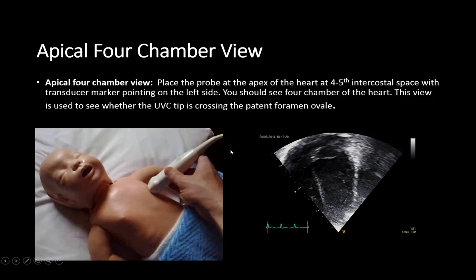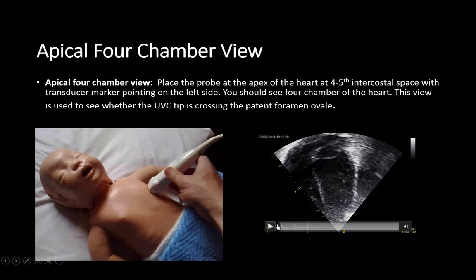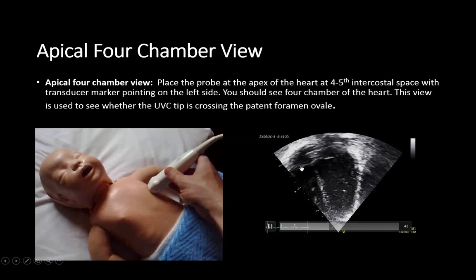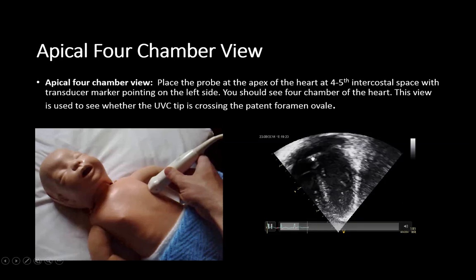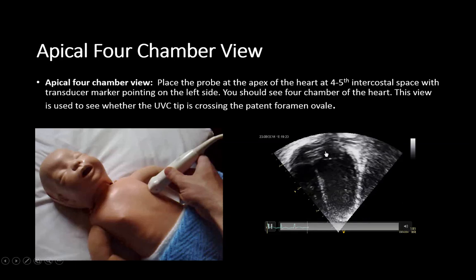The apical four-chamber view is another position used to assess whether the catheter tip is crossing the patent foramen ovale. The transducer is placed at the fourth and fifth intercostal space at the cardiac apex in the mid-clavicular line. From there you can see all four chambers, focusing on the relationship between the right and left atrium. The catheter crossing the inter-atrial septum towards the left atrium can be clearly identified in this view.